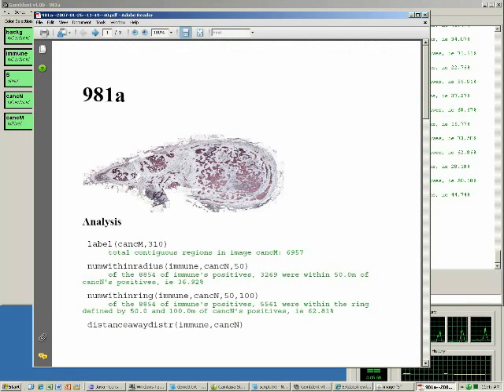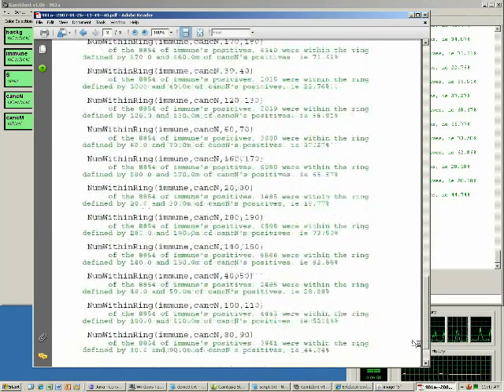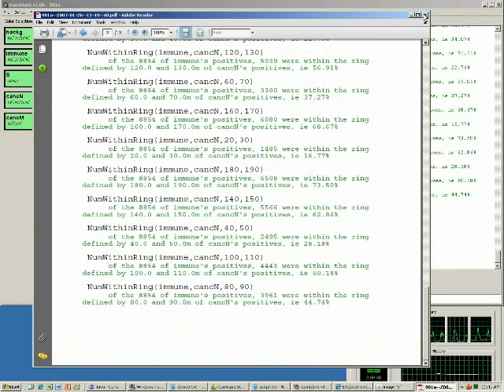I hope you got a glimpse of the power of GemIdent technology in these 3 demos. The development is still in its infancy. Support for more automated microscopy systems and new analysis functions will be added in the near future.